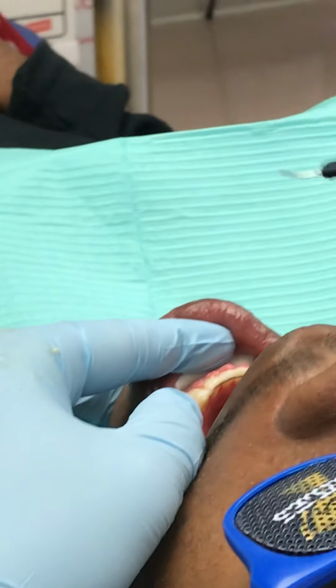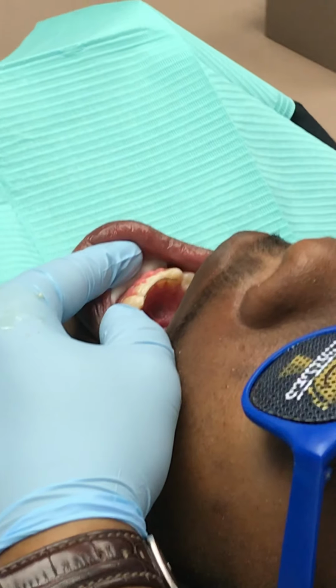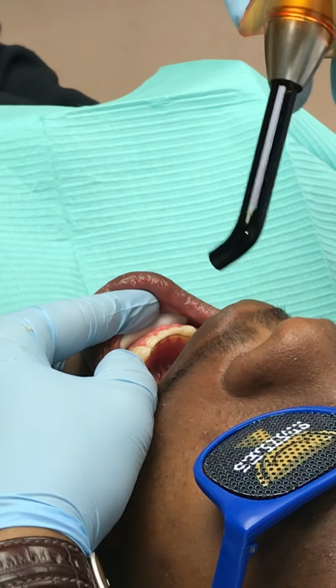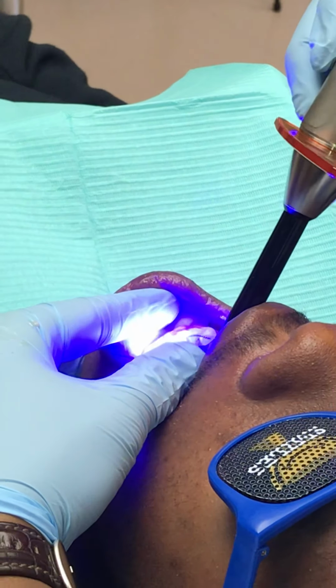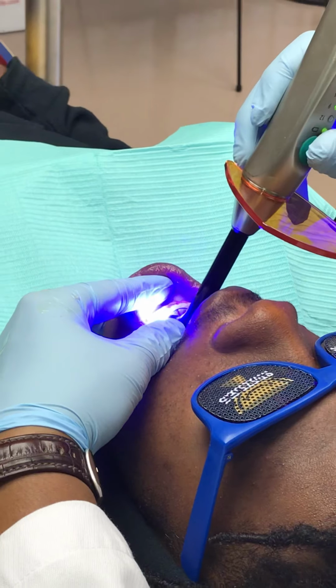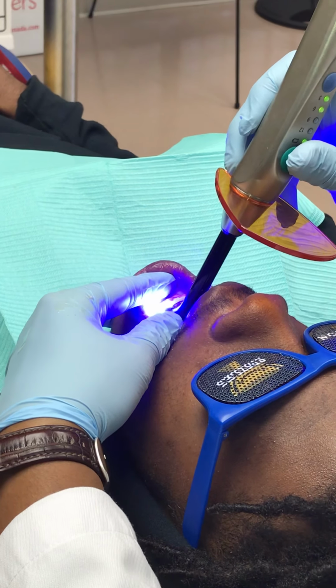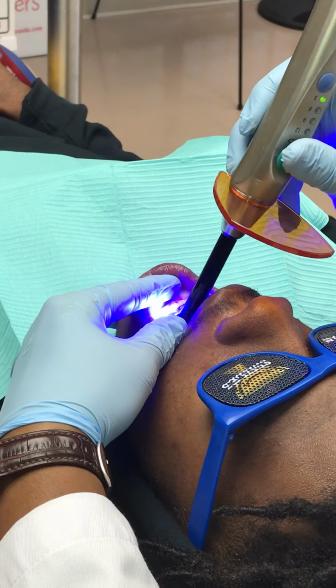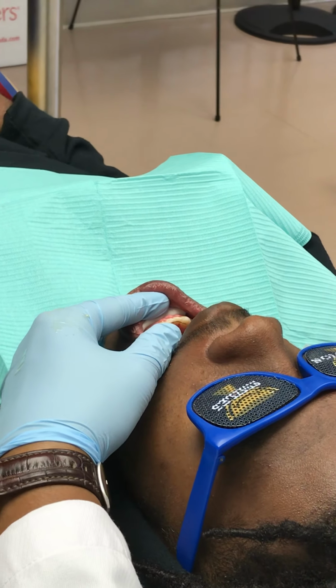Okay, so the wire in the lower right canine is kind of off a little bit, so I'm gonna cure this lower left one so that way it stabilizes the whole wire, and then I'll go back to the lower right. Oftentimes I'll bond both the left and the right canines first, cure them both first, and then go back and cure the rest of the lower incisors.